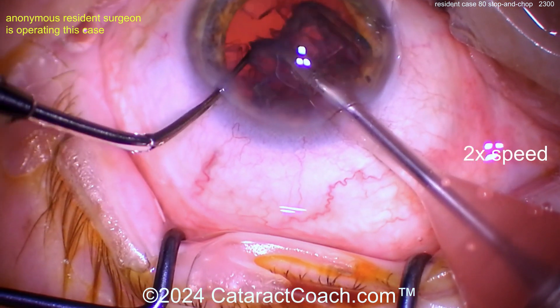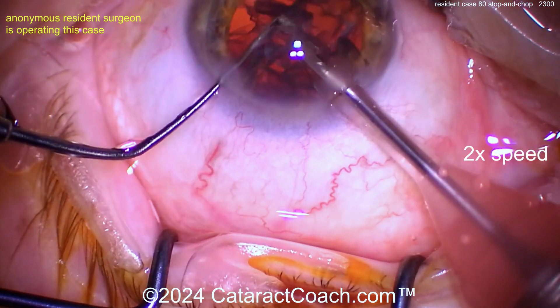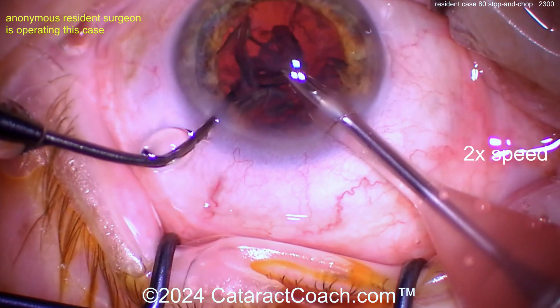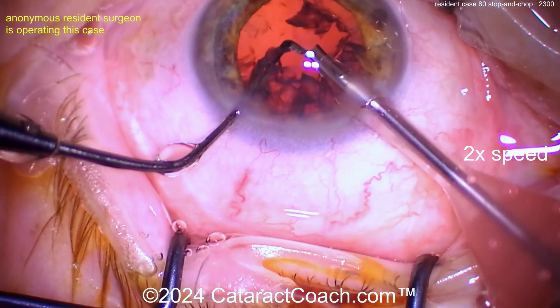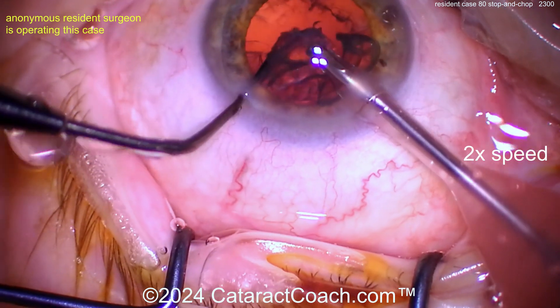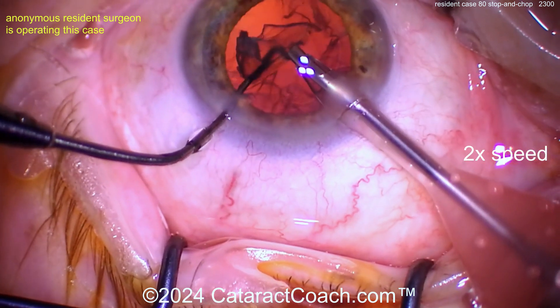It's coming off screen a bit — look at the Purkinje image, you see how they're not in the center anymore? Put your hands down a little bit, don't lift up on your hands. Get that eye back in primary, set up your scope a little better. And there you go — last piece has come out beautifully.